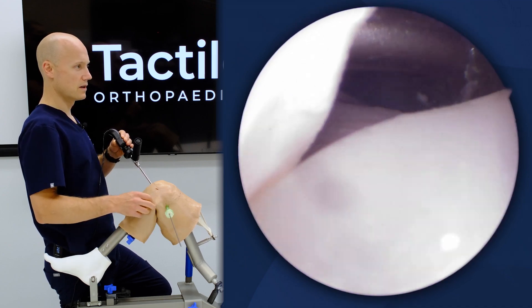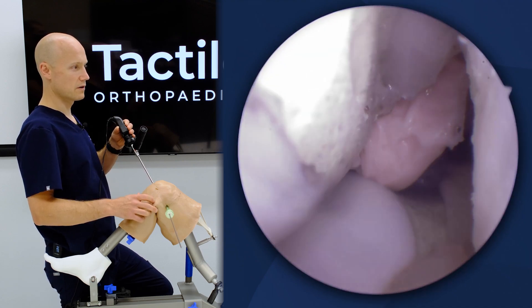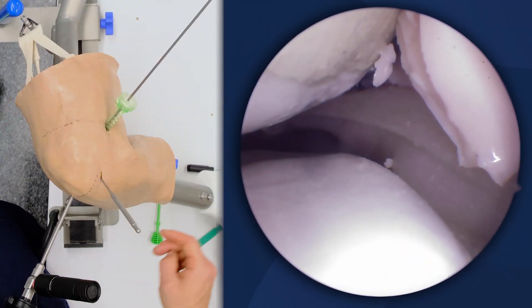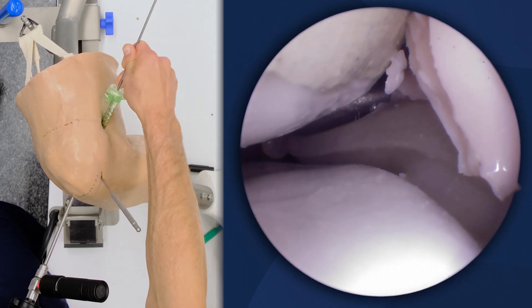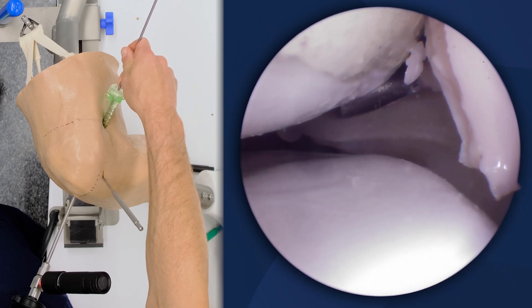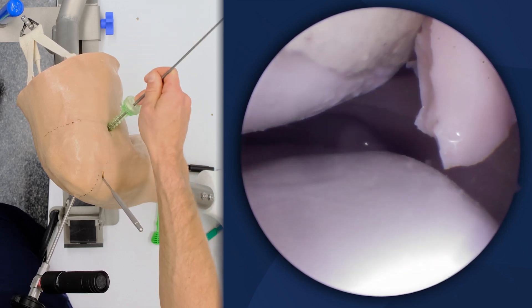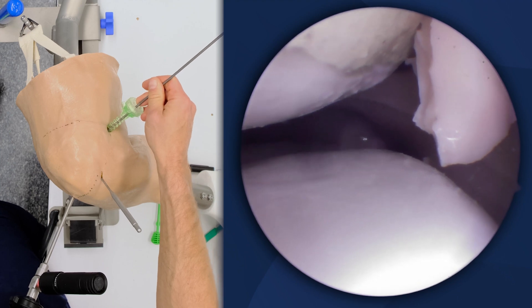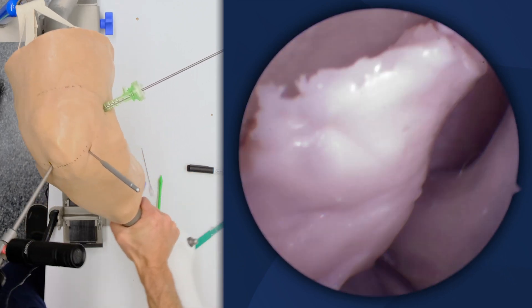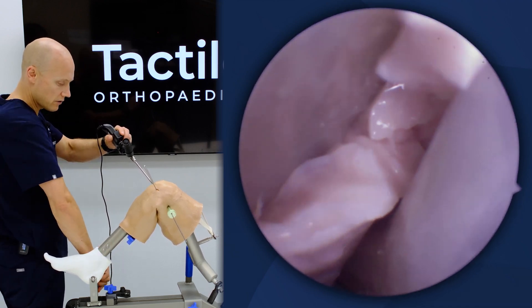I like to establish my posterolateral portal from inside out — I come and enter over top the ACL, punch through, and I've come over top the ACL and through that septum. You can see my trocar has gone through the posteromedial septum, behind the PCL, and now I'm over top the lateral meniscus. I want to make sure I'm safely past the level of the artery with this trocar in this figure four position. I'm going to keep that there, then switch it to 90 degrees and lock the lateral compartment in.